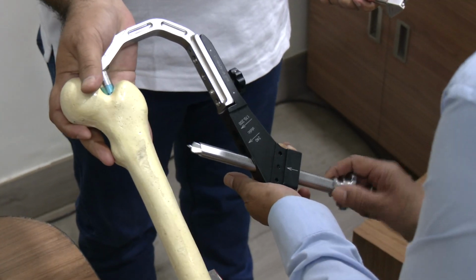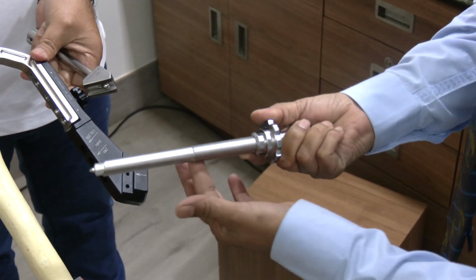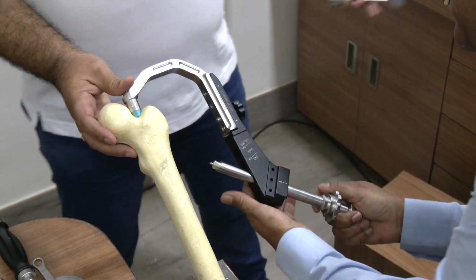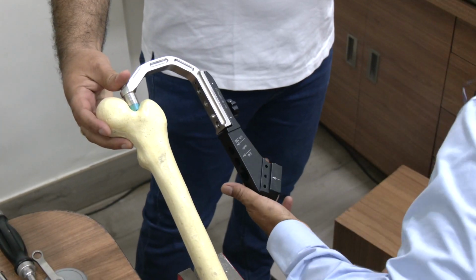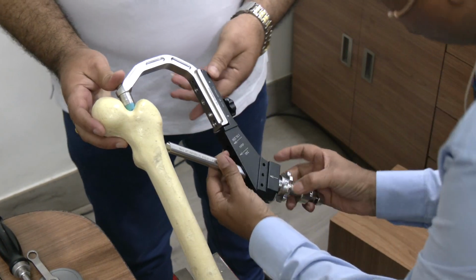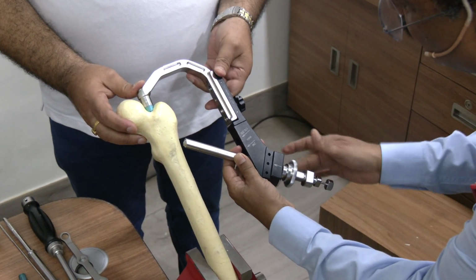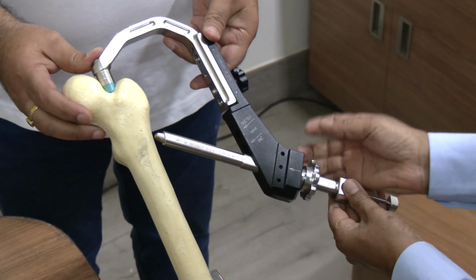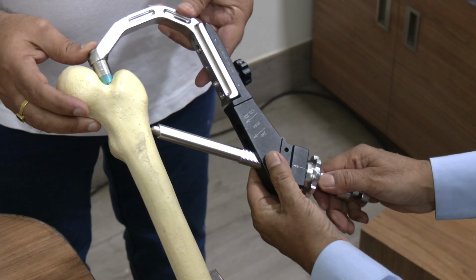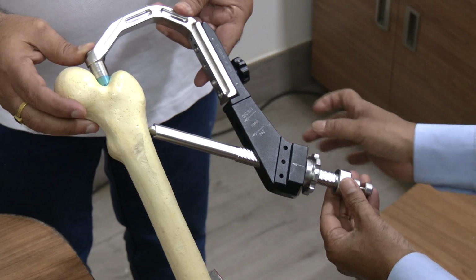Now this turnbuckle and the sleeve have a flat surface. The flat surface should face the flat surface in the jig. So then push this and you can lock it. Here it is above. Okay. I'll just keep this a little out, just for demonstration purposes. Now what we have to do is lock this properly so that the jig will not come out. That is very important at this stage.